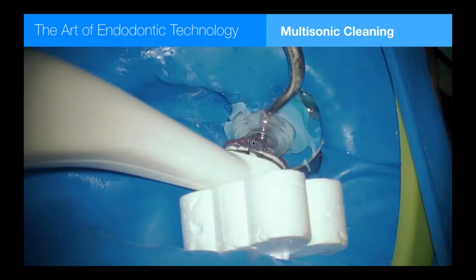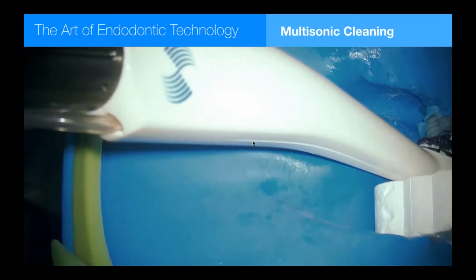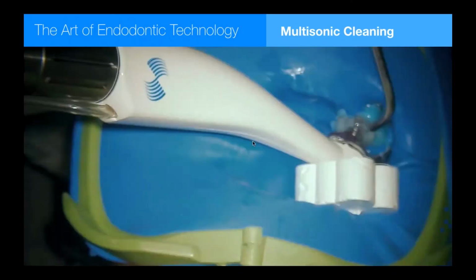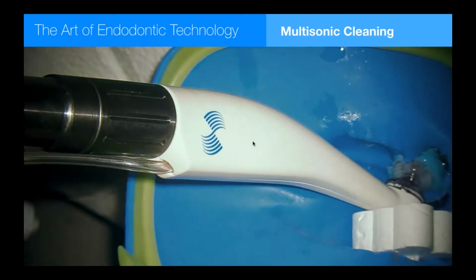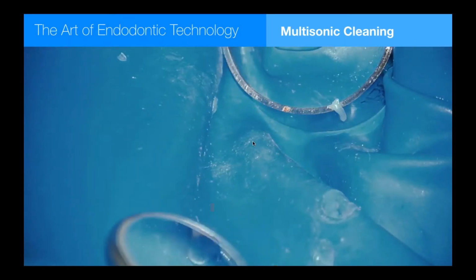I've chosen a sealing cap that makes the right length of extension of the operating tip. I like to put a little bite block in there. I have the patient help hold the PI against the tooth. It's only 8 minutes to do full cleaning in all 4 canals.